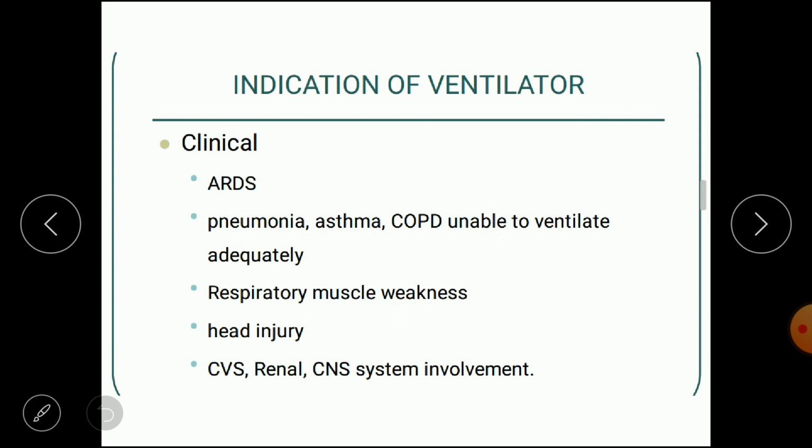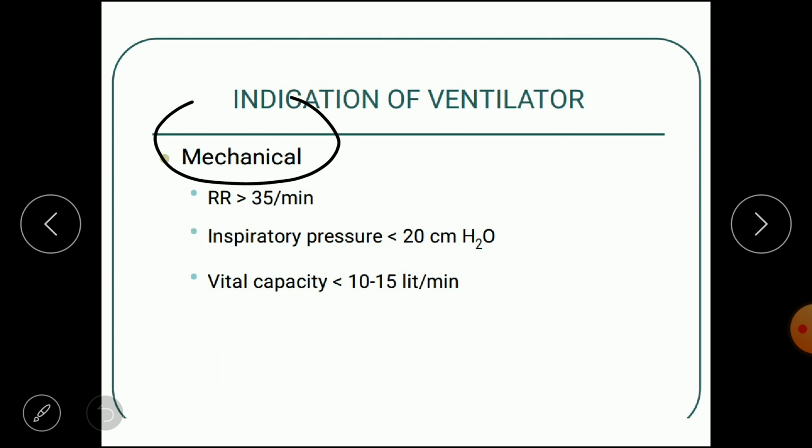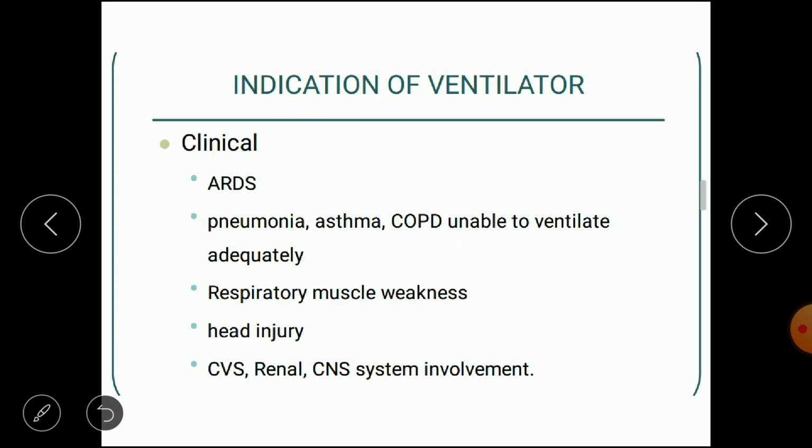Then what are the indications of a ventilator? Indication means in which condition a patient requires ventilation support. So there are two types of indication. First is clinical indication and second is mechanical indication. So first we see the clinical indication.